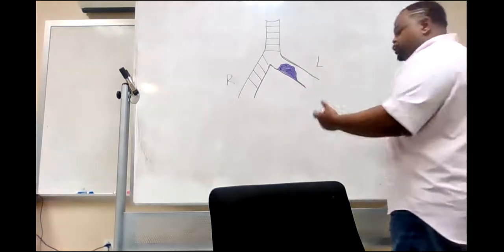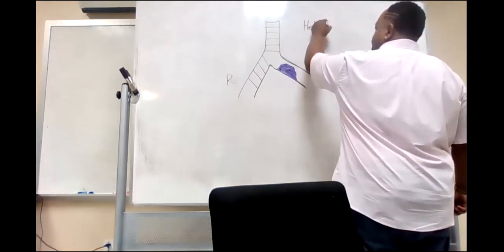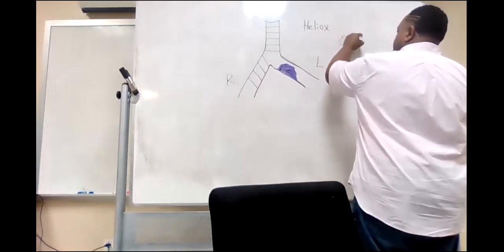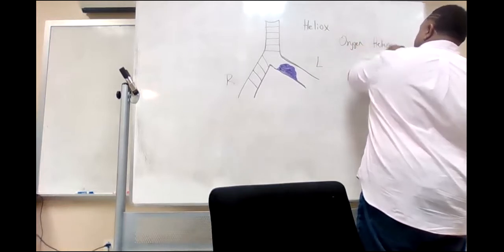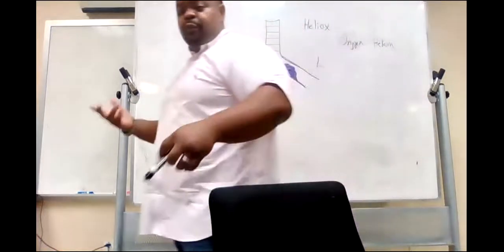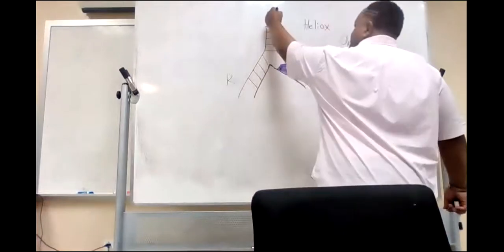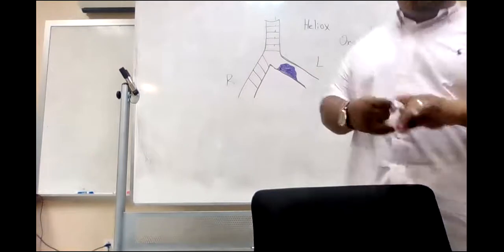So this is when we will use heliox, which is oxygen mixed with helium. And we have different percentages of that that we use. My blue. All right. So as I'm breathing in oxygen, right? And I'm breathing in this oxygen. Let me pull this off.